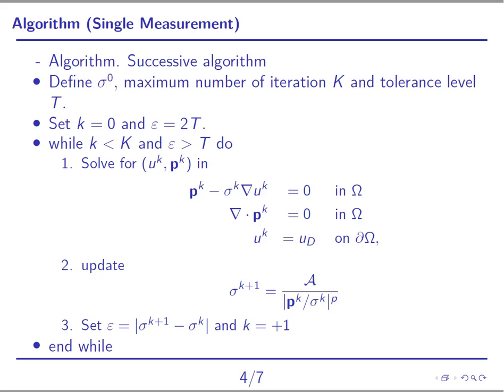By using the mixed finite element formulation, we can easily update the conductivity from the power density measurement.